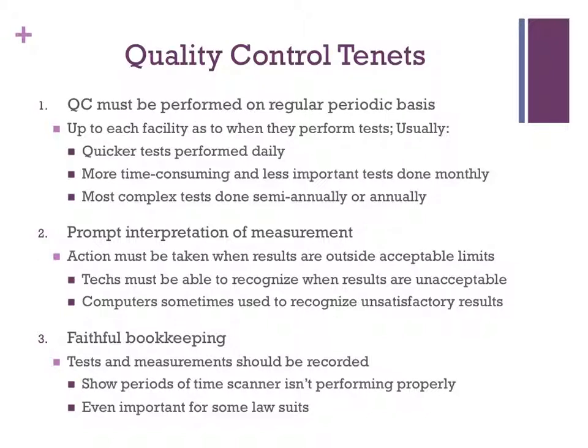There are 3 basic tenets or principles of quality control. First is that QC must be performed on a regular, periodic basis. Now, it would be ideal if this was able to be done after each patient to have maximum assurance that the scanner was always operating correctly, but this would take way too much time, especially time away from the next patient. It is up to the facility as to when they perform what tests. Quicker tests can be performed on a daily basis, and more time-consuming and less important tests can be completed less frequently, maybe monthly. The most complex tests could be done semi-annually or annually.